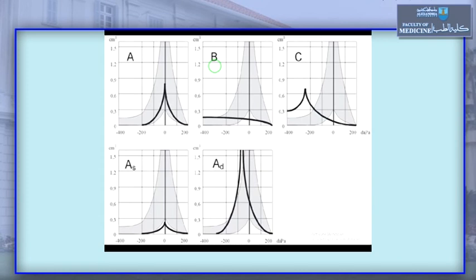The third one is type C tympanogram, where there is normal compliance. As you can see here, it's about 0.7 cc compliance, normal compliance, but negative middle ear pressure. Look at the peak of the pressure. It is opposite about minus 250. That's well below the normal range of minus 50 decapascals. So that's negative middle ear pressure. Why is it negative? Because the Eustachian tube is not functioning well. So that's pathognomonic for Eustachian tubal dysfunction. Type C tympanogram, pathognomonic for Eustachian tubal dysfunction.